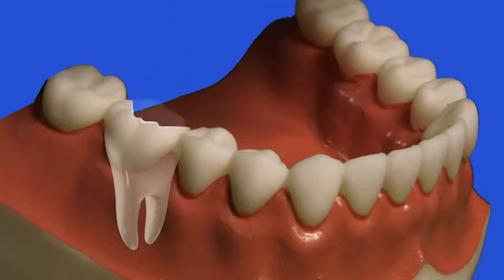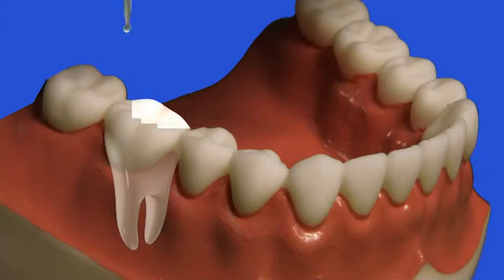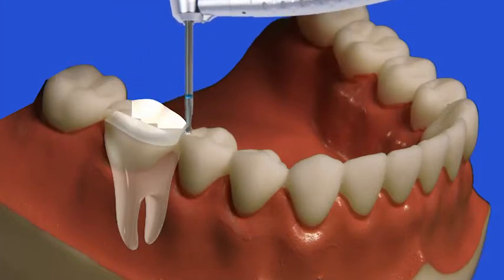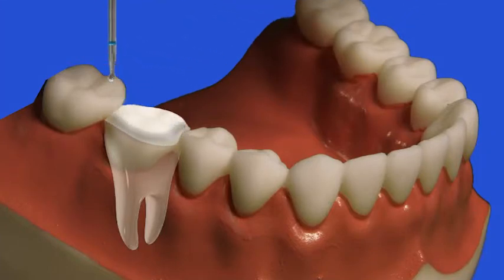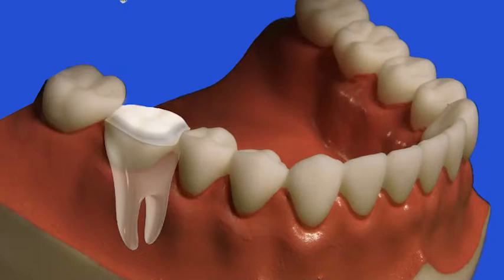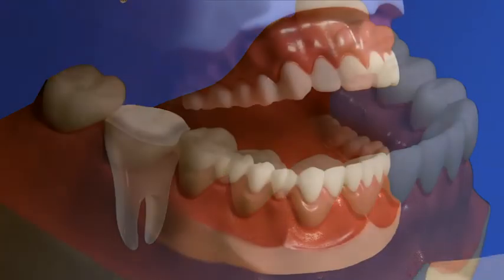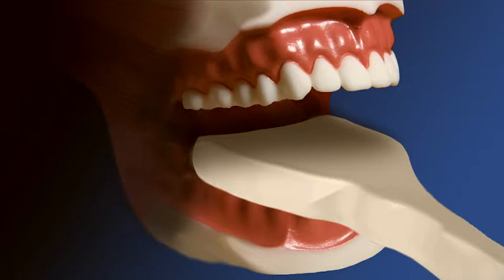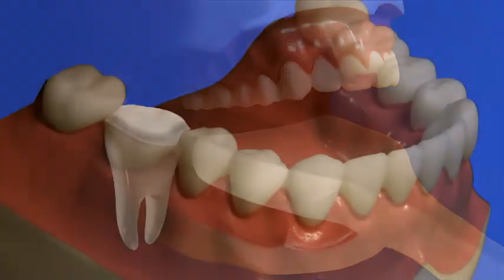The voided area is filled. The preparation is now refined to create a consistent surface that the final crown will fit. Impressions of your teeth are made to create the crown restoration.